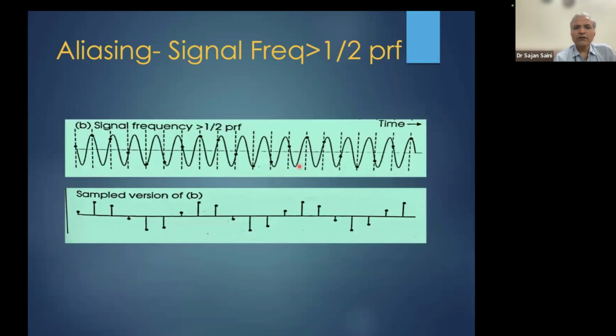What will happen now if I am sending the ultrasound wave with the same frequency, but the blood has a very high frequency, much more than we saw in the previous slide? Now my Doppler shifts are calculated here, and accordingly they are represented here. This is represented here, this is represented here, and so on. And now the Doppler shifts are like this.